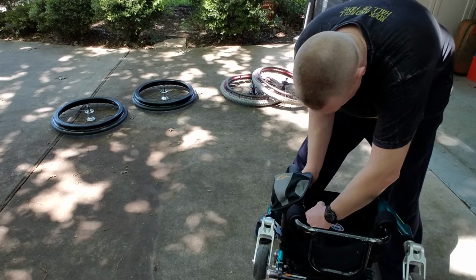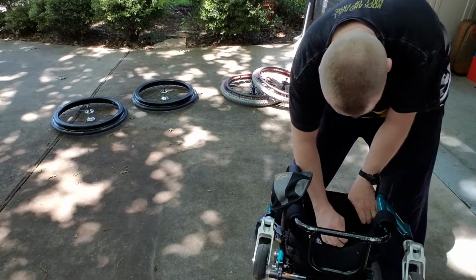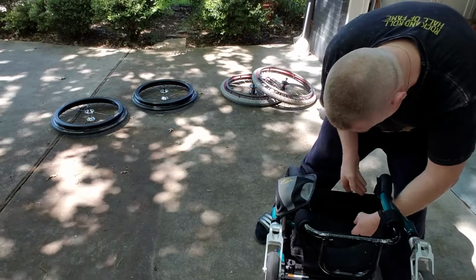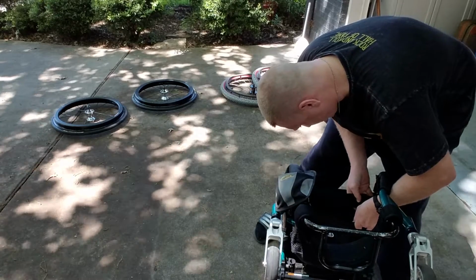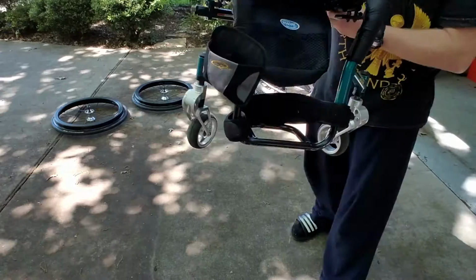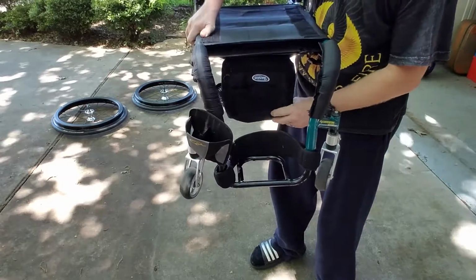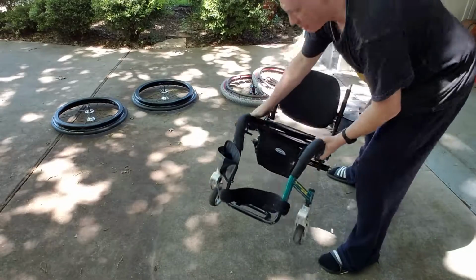Just take it, clip it in, and clip it in, and then it just hangs like this. So it's behind your legs, but it's still there. You can reach down and get stuff. It's just another place where you can carry small items while you're in the chair.